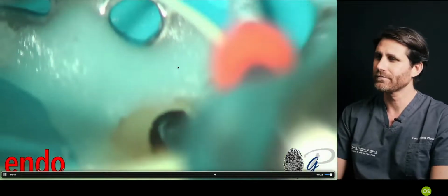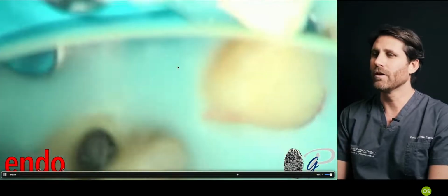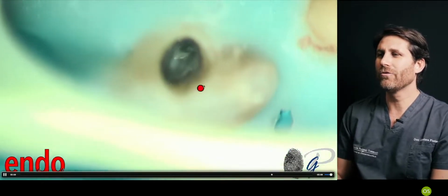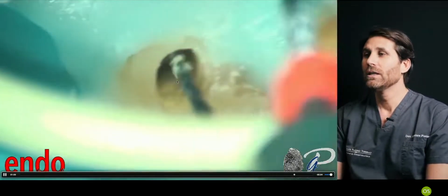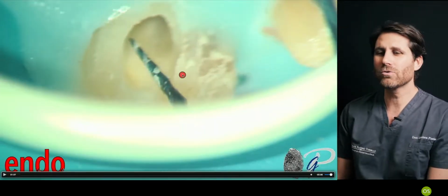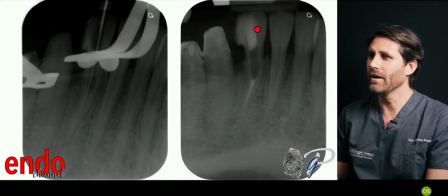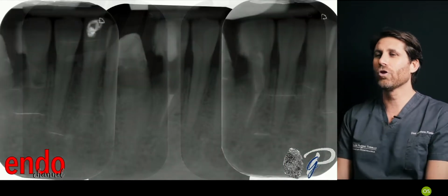as we will see in other parts on this channel, and we finished the preparation, but you can see which big amount of tooth loss we had given by the internal root resorption. So this access cavity in this case was completely different, because the need in this case was to find that small dot of the canal, and the access cavity was really destructive in this case, but not more destructive than the internal resorption was.